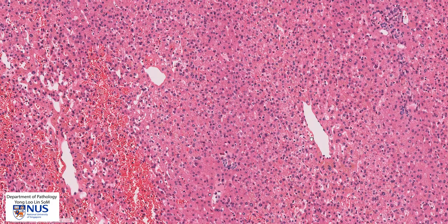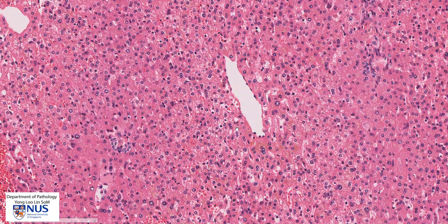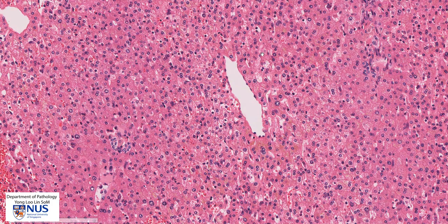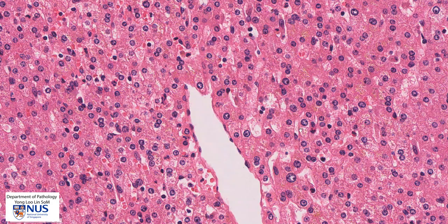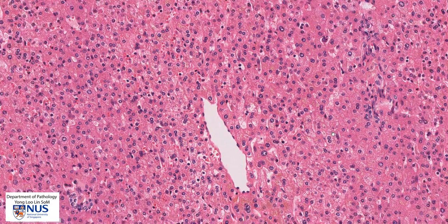This is a central vein. We can see that there are hepatocytes arranged in slender trabeculae, usually around one cell thick, at most perhaps two cells thick. The hepatocytes are quite polygonal in shape. They have rounded nuclei, which are fairly uniform, with very smooth nuclear membranes and granular cytoplasm, and they have quite abundant cytoplasm.